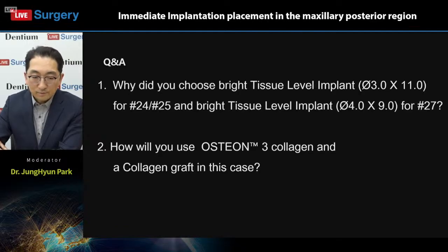The Bright tissue level is available from a 2.0 millimeter diameter fixture, but since this is a posterior area, they need to withstand occlusal force. So I used 3.0 millimeter for the 24 and 25 sites and 4.0 for 27.